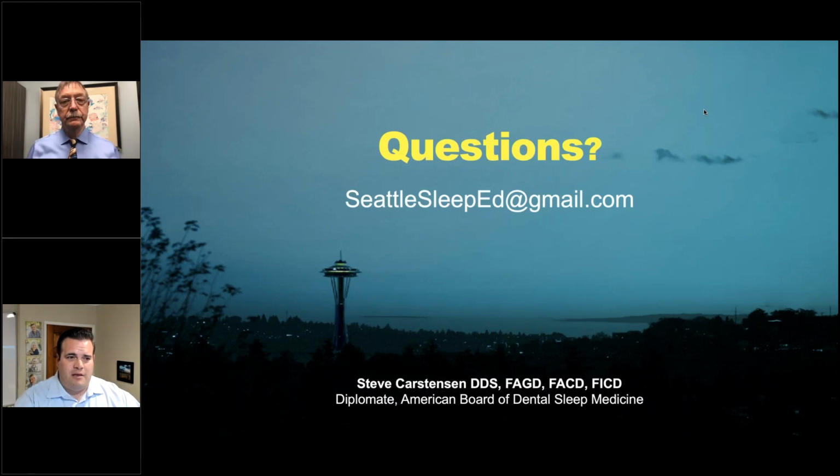Speaking of a thinking person's game, when is it time to refer out to an ENT for turbinate surgery? When they just can't get their nose to work as well as it should, or if you take, say, a cone beam, for example, and it says, well, this is completely plugged. Well, you're fighting uphill if you think you're going to fix the oropharynx if they can't breathe through their nose because the turbinates are just giant. And they don't take out turbinates anymore. They just shrink them.